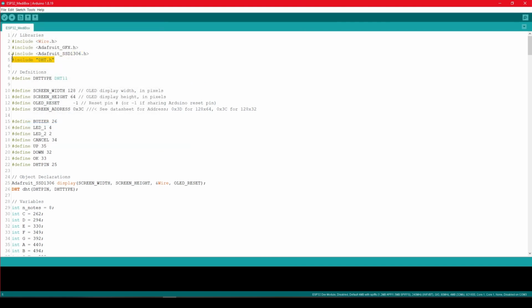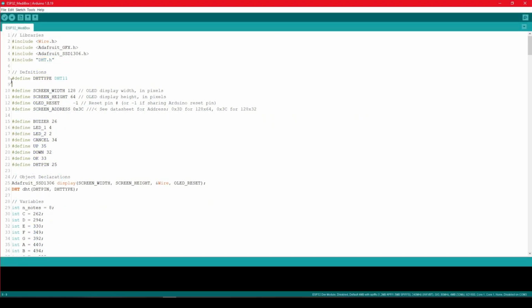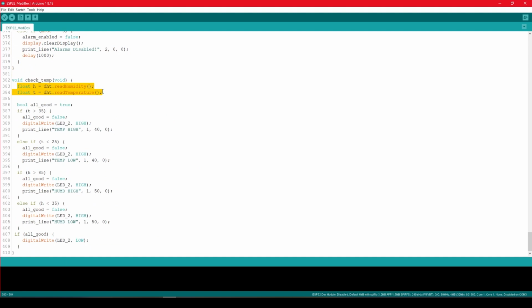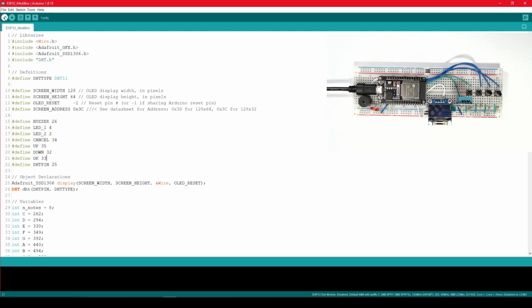The first modification I have made for the DHT11 is replacing the library. In the simulation we use the DHT ESP.h. But now in our code we are using DHT.h, and here we can define the sensor type, and we have also made the necessary modification in the code according to the examples as well. We also had to do some modifications to the pin numbers based on the circuit that we made on the breadboard. First of all, I will verify my code by compiling it.